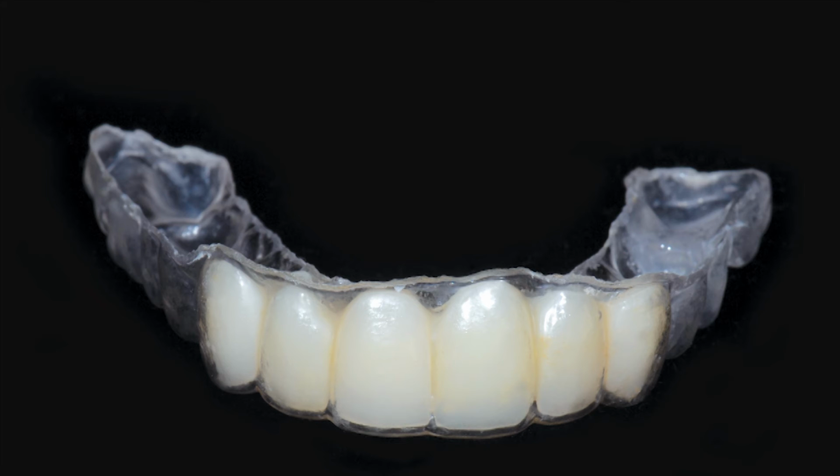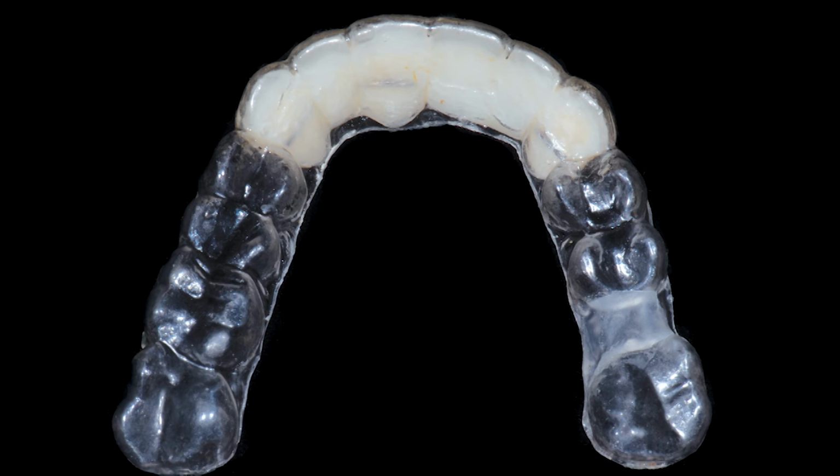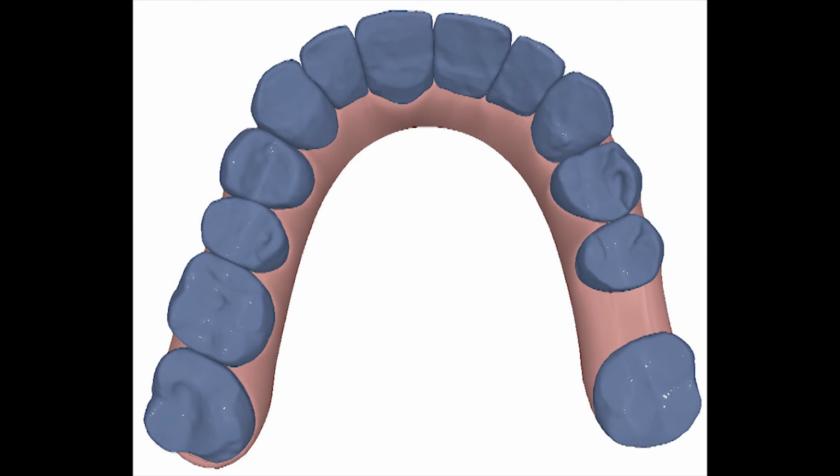A thermoplastic Pontic appliance was fabricated in office. This included the use of composite resin to fill the span of the missing 6 anterior teeth. The plan to maintain the maxillary arch and prevent any tooth movements was verified using the ClinCheck software.